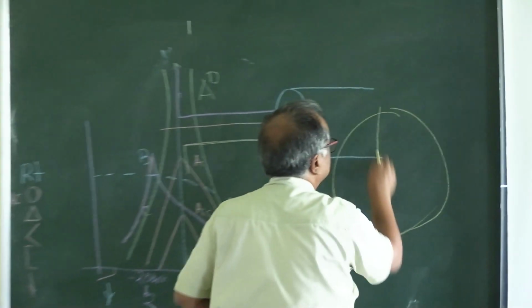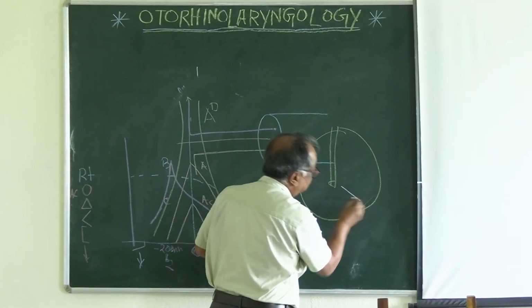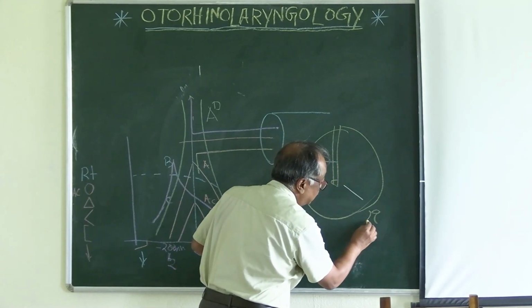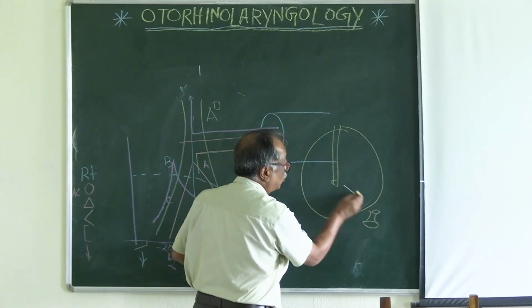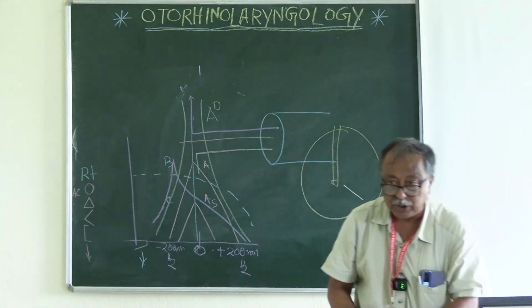Grommet tube. For otitis media with effusion, the treatment is tympanostomy in the anterior inferior quadrant, with a radial incision. Radial incision. This is the malleus, and you will give a radial incision, and you put a Grommet tube. The circumference is bigger and it will go inside, and this portion will sit on the tympanic surface of the tympanic membrane, mostly for ventilation of the middle ear cavity.